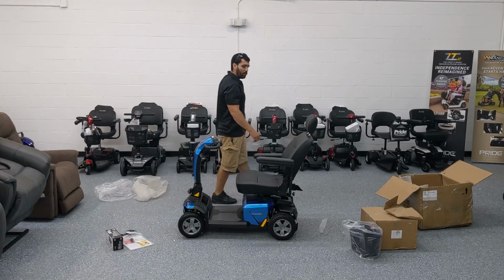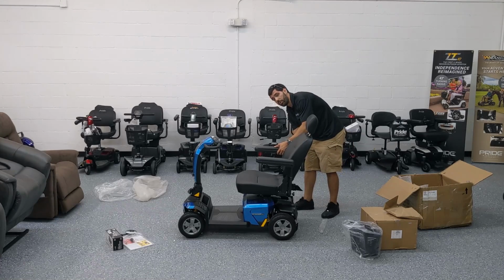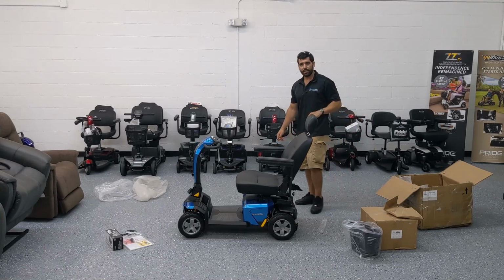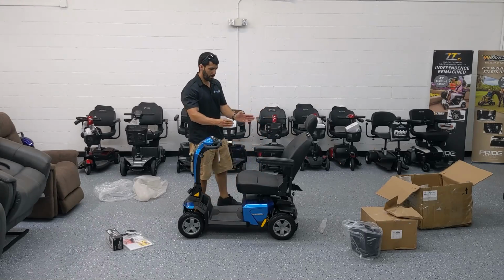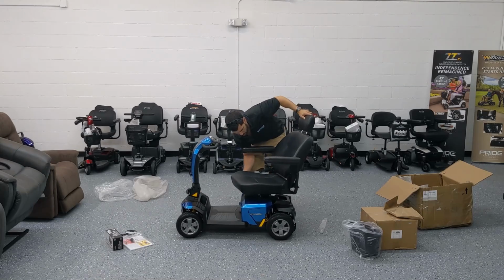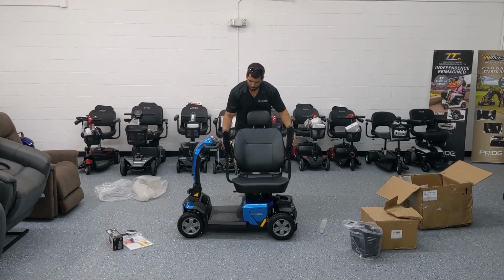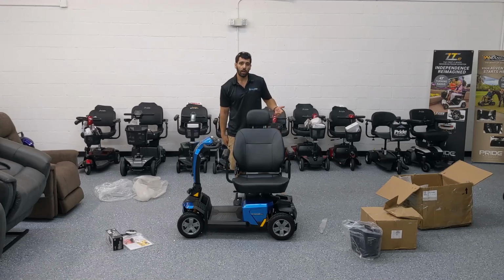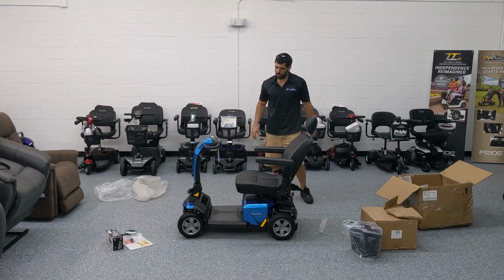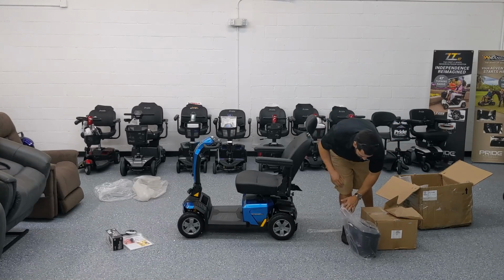So not only can you adjust the height of the armrests, but you can adjust the width as well, as I showed you earlier, by simply taking out the pins in the back, releasing the tension adjustment knob, and bringing the armrests out wider. So really have a lot of features here as far as the armrests go, both on the width adjustment, the height adjustment. You can flip them up, you can remove them, making the scooter a pretty versatile and convenient model. So we're almost done at this point assembling it. There is one other part here that we haven't put on yet, which is the basket.